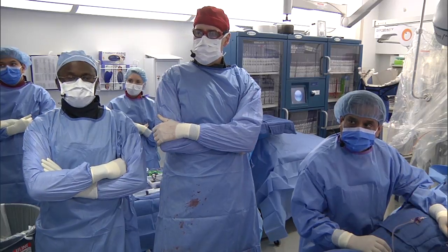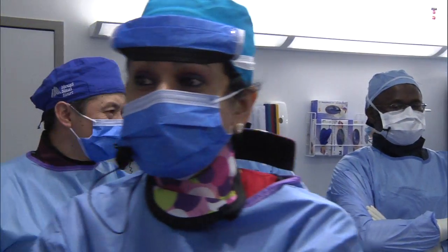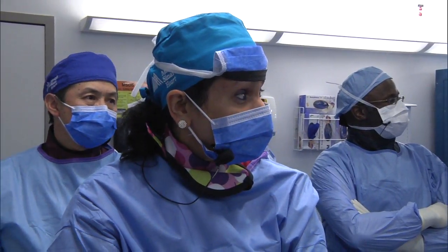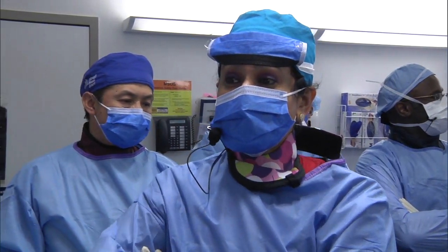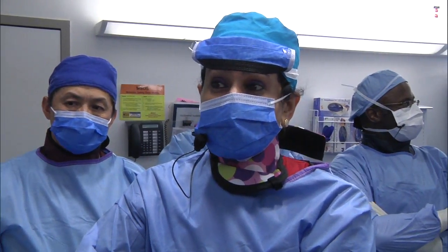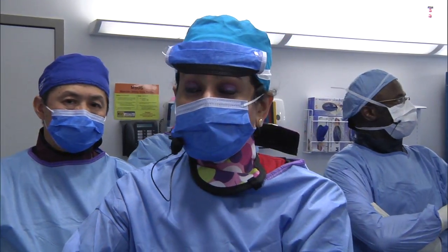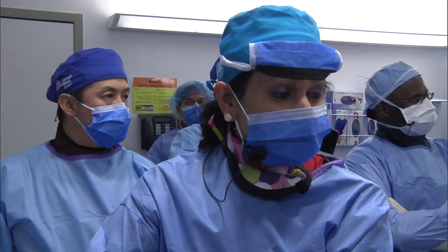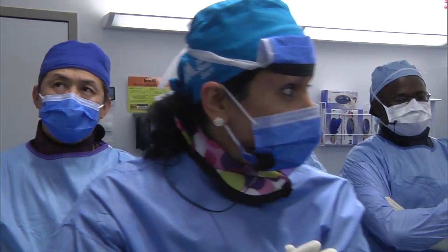Partho and Dr. Sharma, does this impact how far into the LVOT you'll start your implantation when you have a unicuspid or a bicuspid valve, or will you proceed in the same manner as if it was tri-leaflet? Yeah, that's an important point which I wanted to ask Partho. Now that we saw that it was unicuspid, I think this is the first case that we are doing, and I don't know if there have been any other cases. What do you think we should be prepared for? I know we have done a BAV in the past, but now we are seeing a single commissure, and the rest of the area is just a valve.